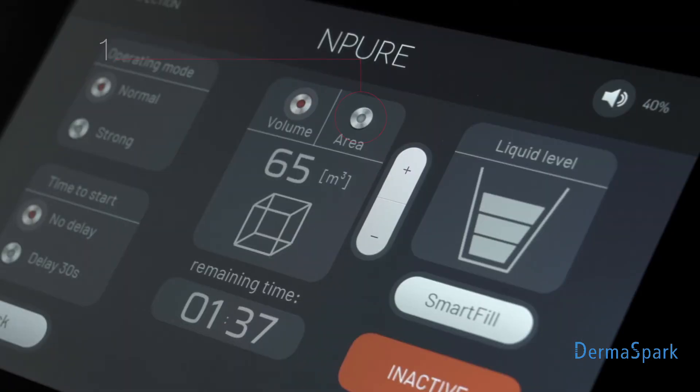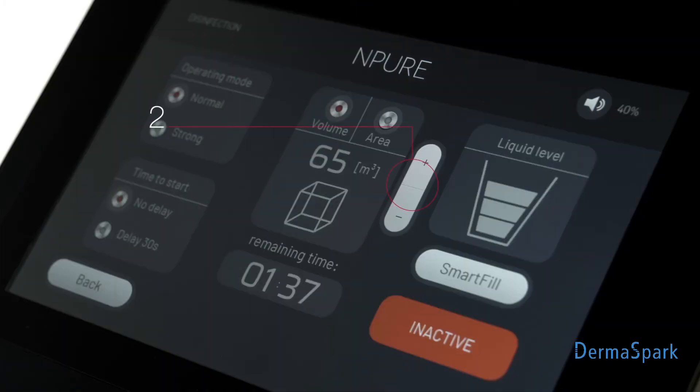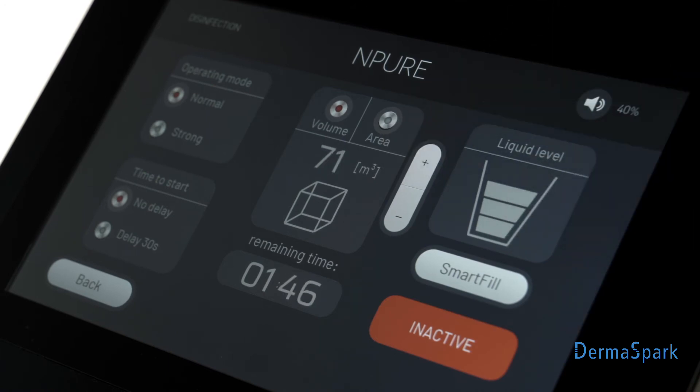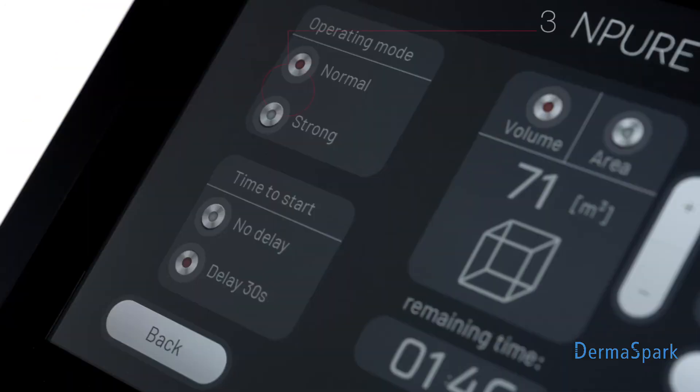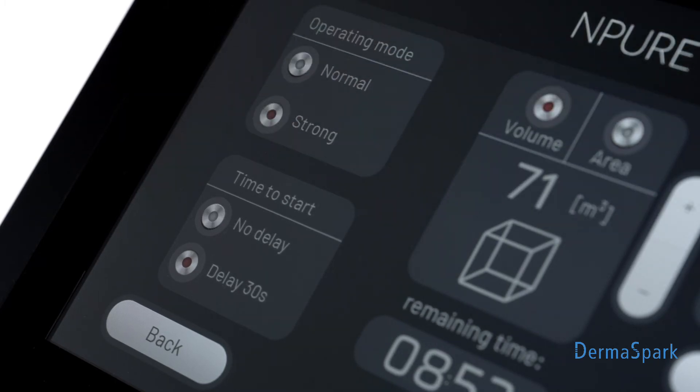Step 1: Select the room size input mode. Step 2: Select the cubic capacity of the room. Step 3: Select the operating mode. Two work programs were designed to ensure effective room cleaning.